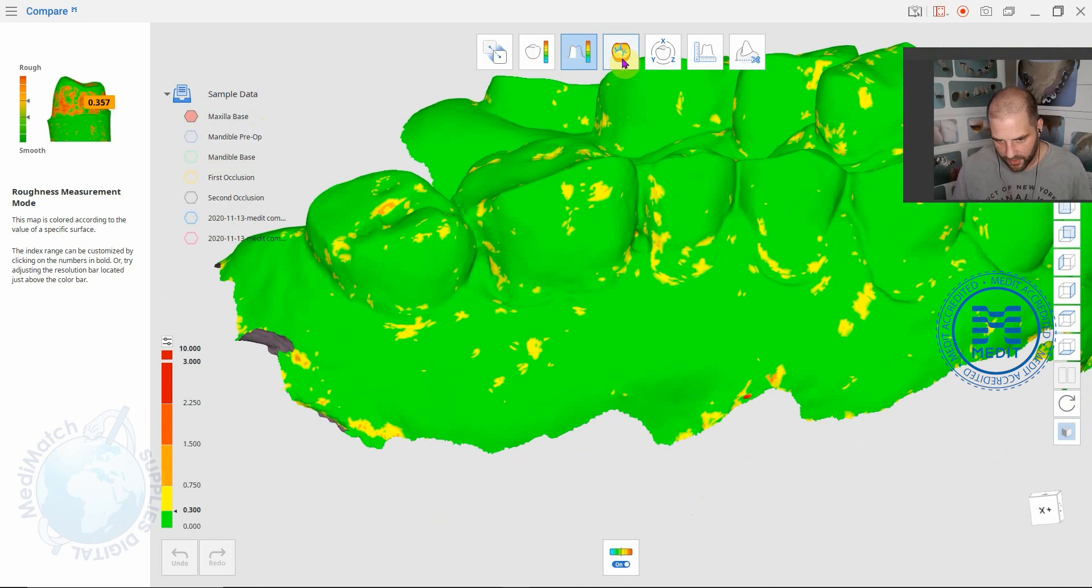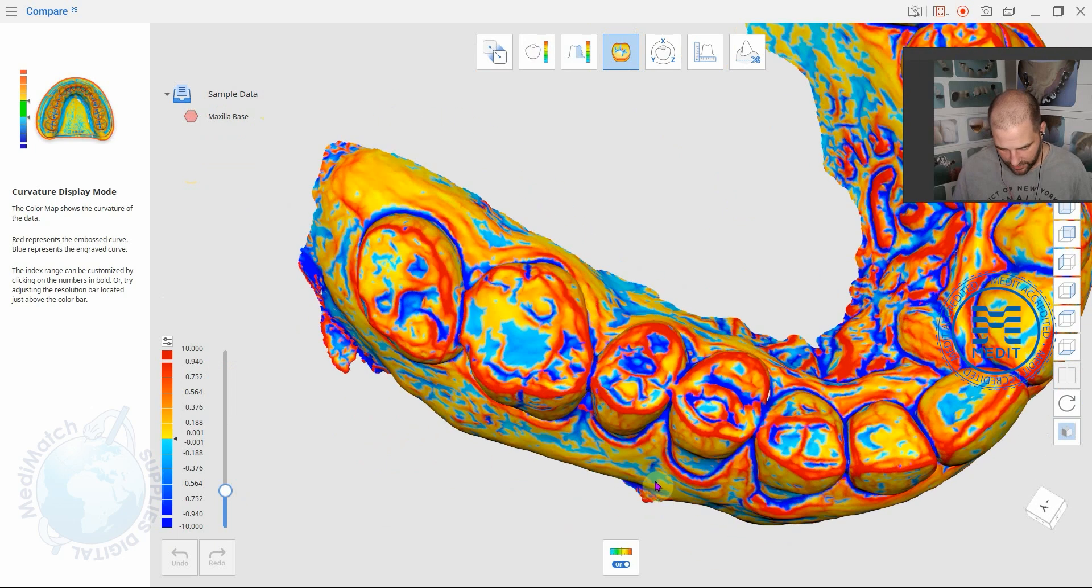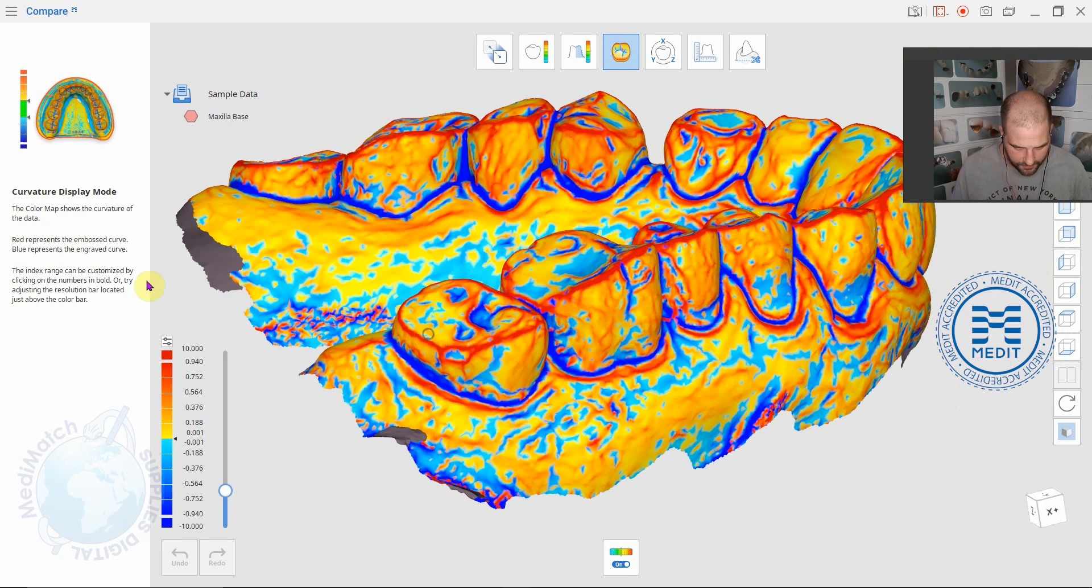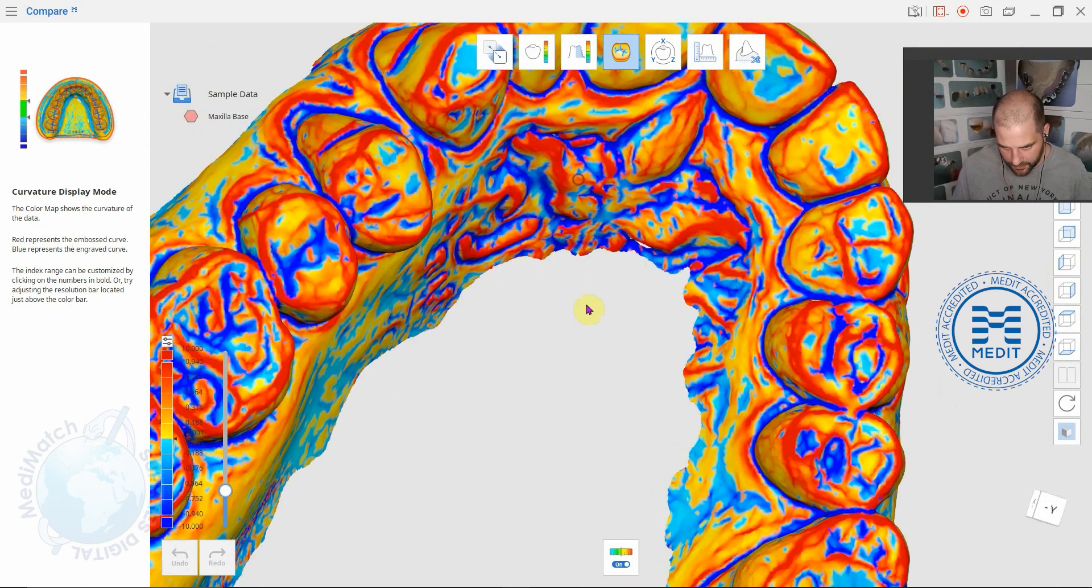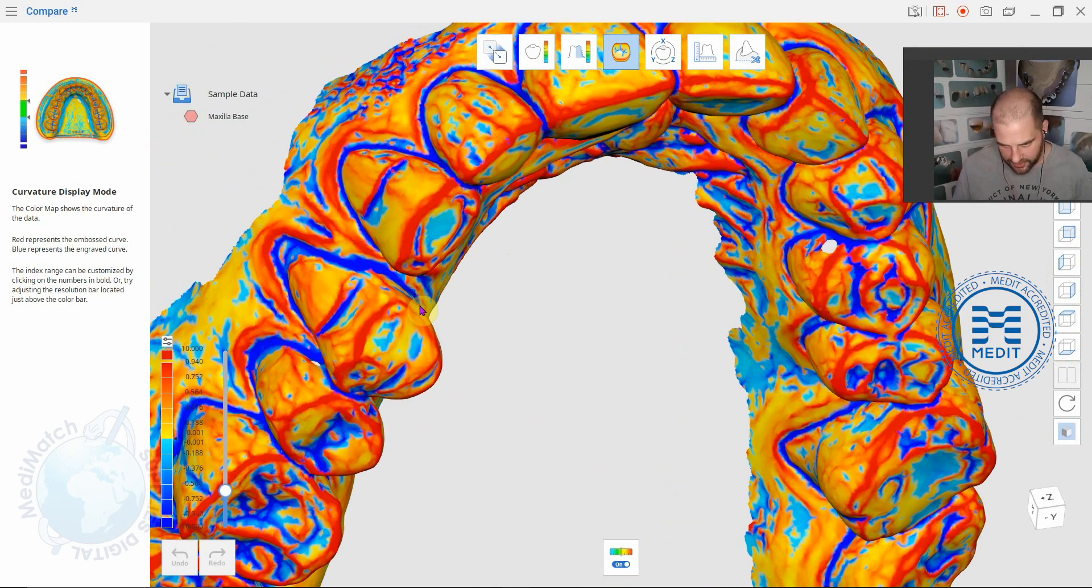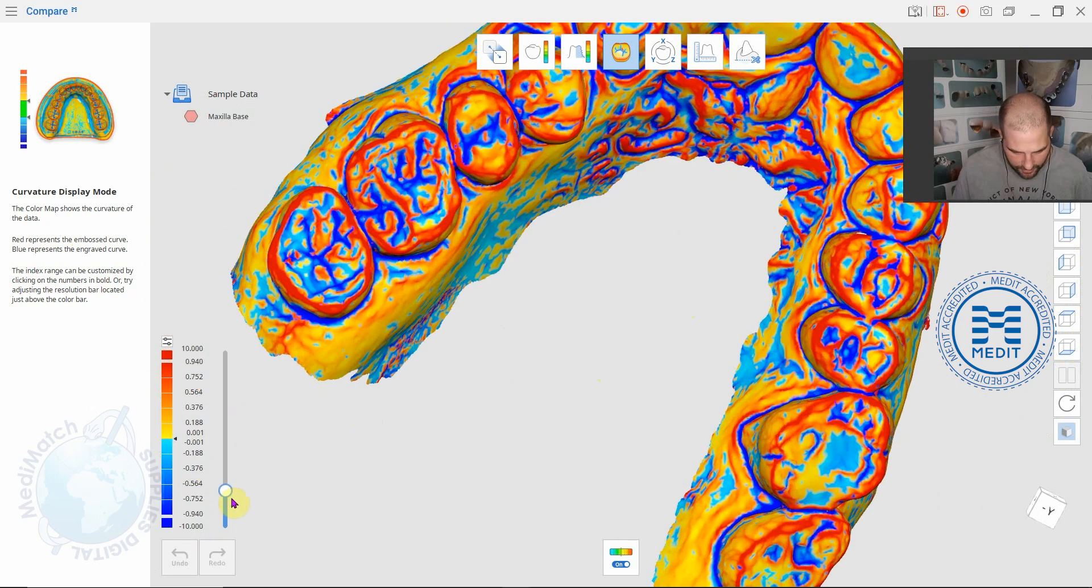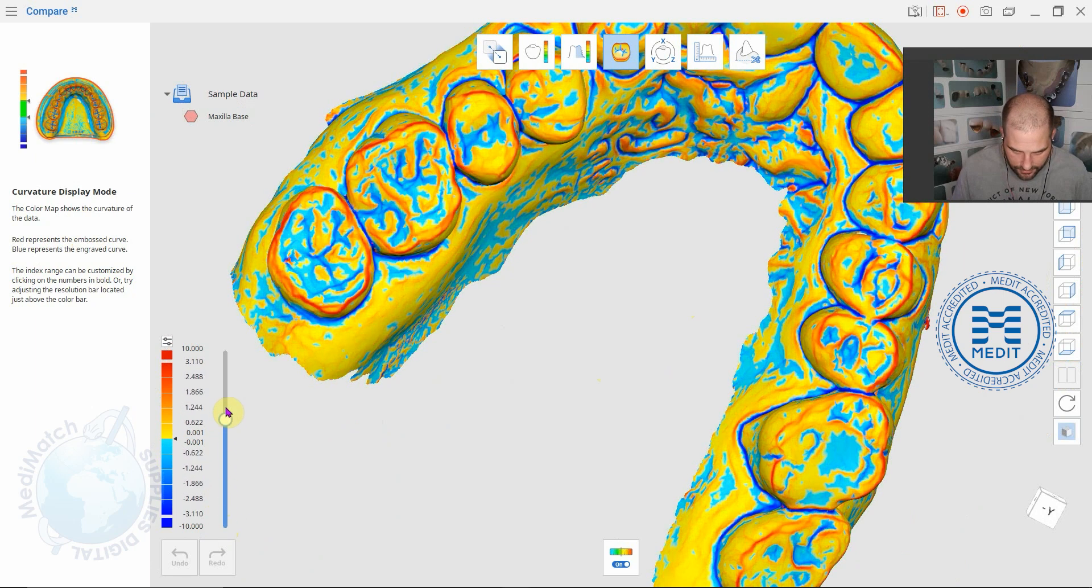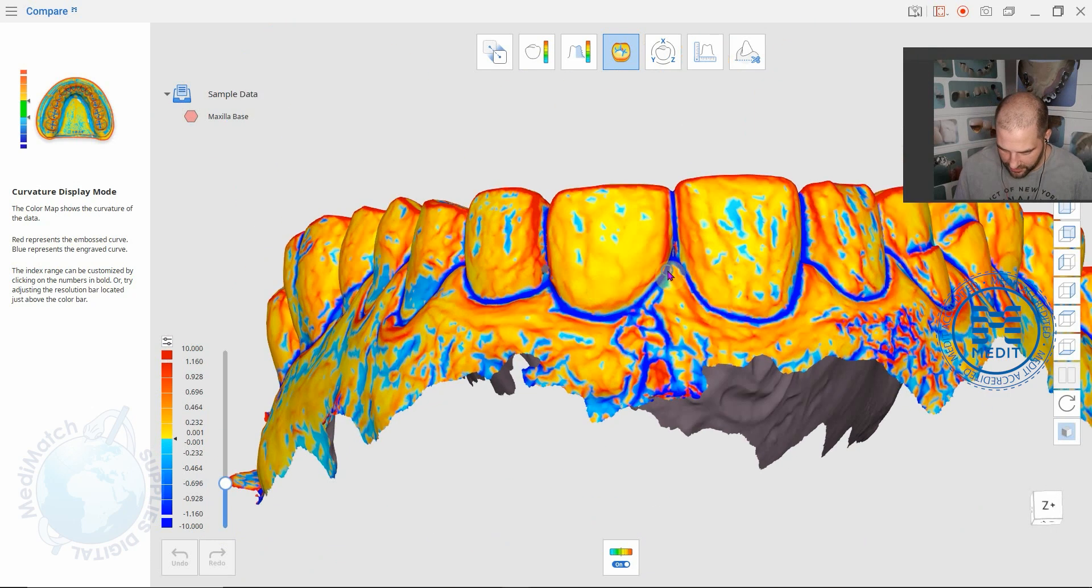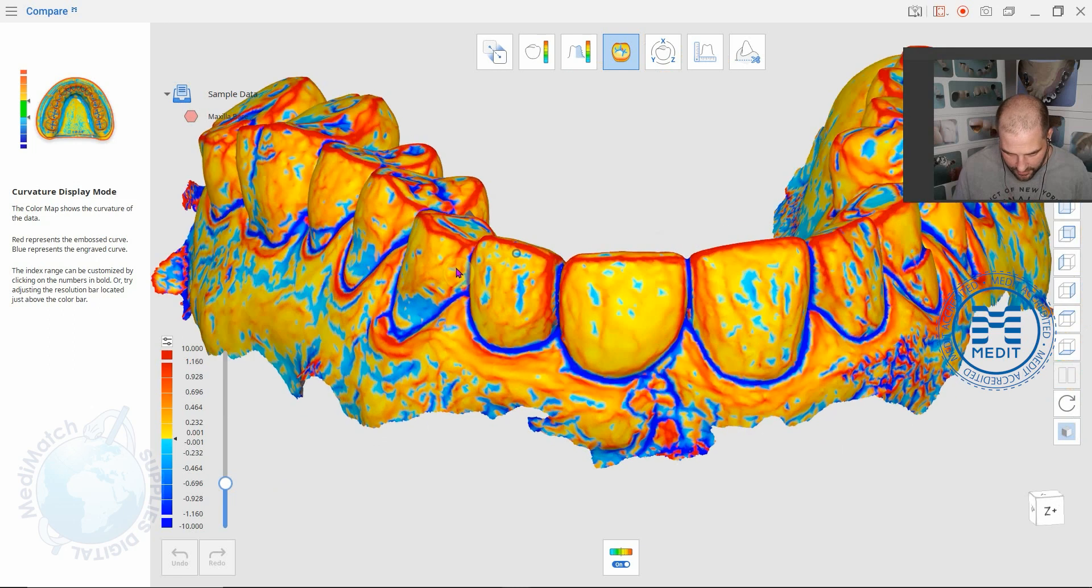The next one I quite like is curvature display mode. It gives you a really nice way of trying to visualize curves. The red represents the embossed curve and the blue represents the engraved curves. So these are negative, the blue, and the red is positive. It's quite a nice view to be able to visualize in a 2D environment a 3D representation. It works quite well. Again you can play around with the resolution here. I really quite like that. It's a really nice way of being able to visualize. You can see all these grooves on the teeth much more clearly.